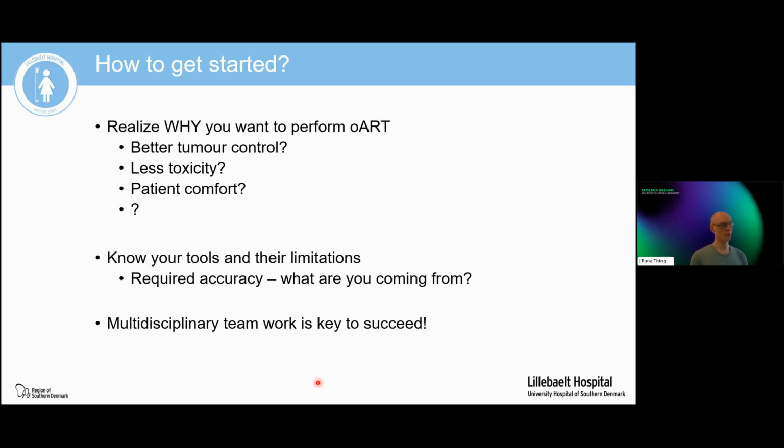You could also choose patient comfort. That is basically what we did. We're aiming to deliver the same quality treatment that we usually do, but with less time in hospital for the patient. Or you could find any other good reason why you want to get started, or what the objective of your first online adaptive treatments are.